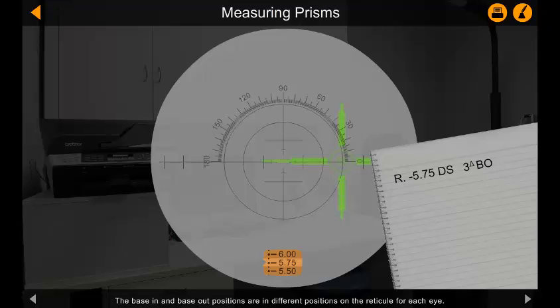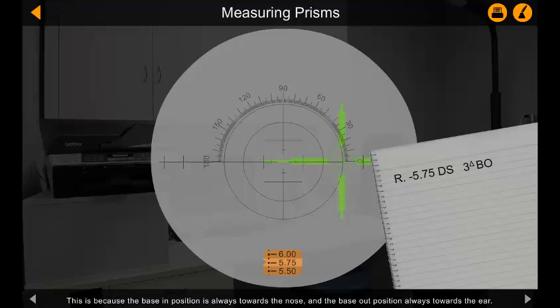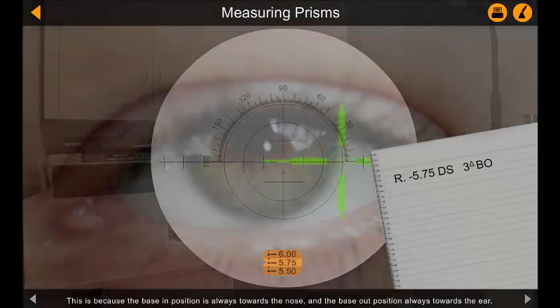The base in and base out positions are in different positions on the reticule for each eye. This is because the base in position is always towards the nose, and the base out position always towards the ear.